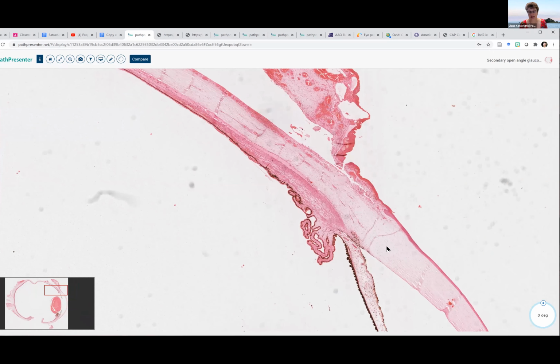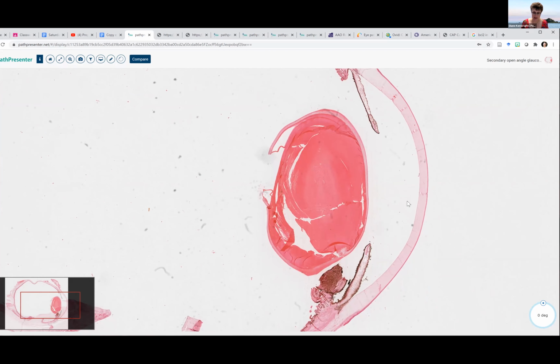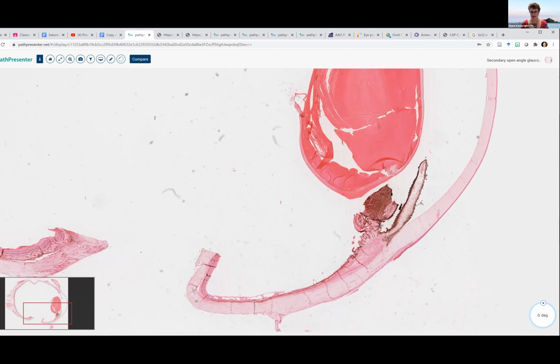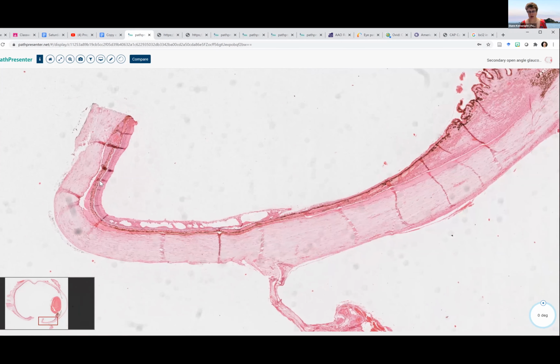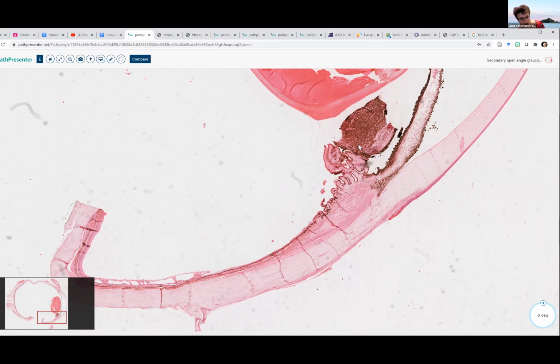So it's always important to look for the change of radiation. The melanomas I've seen have been taken out because the radiation's failed. So we've usually got an area of necrotic melanoma surrounded by vital, live melanoma. And then we get the characteristic changes of radiation in the surrounding retina, which are gliosis, vascular changes with prominent endothelial cells and thick walls in the vessels, and inflammation. So always comment on that. If you have a melanoma that you think might have been treated, have a look for the radiation changes.